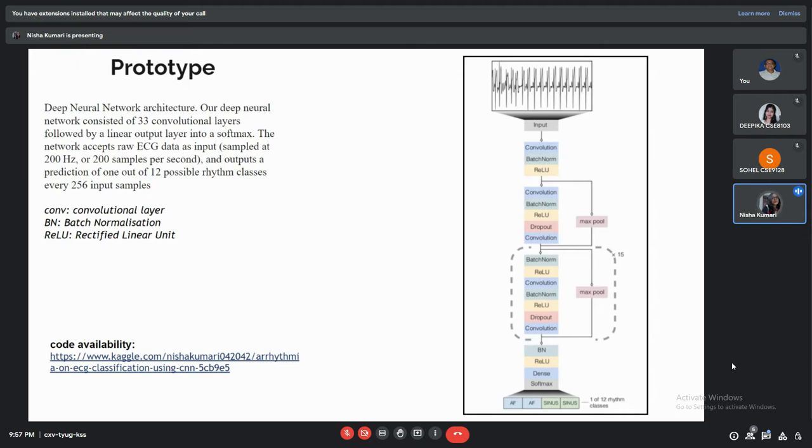That is done in order to reduce the noise in our data set, so that our deep learning model, our neural network, could only focus on the valid part of the data, the data which actually matters, which is actually needed in order to bring valuable results to our neural network model. So here we can see that we are following a max rule.